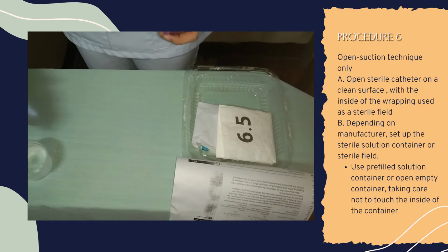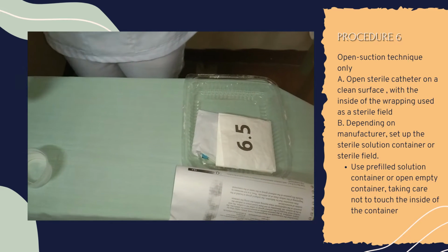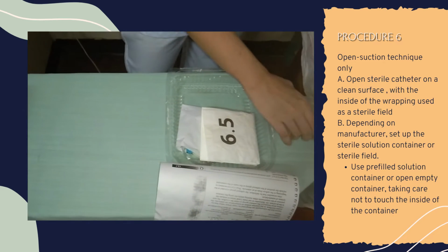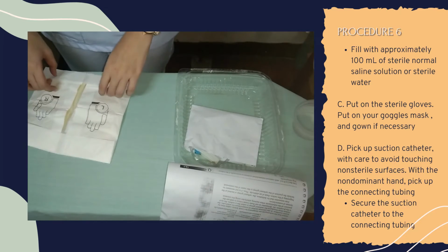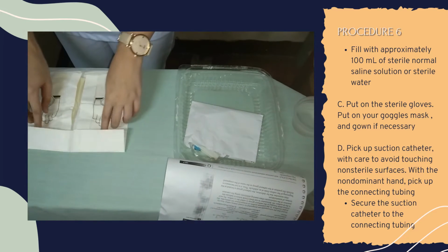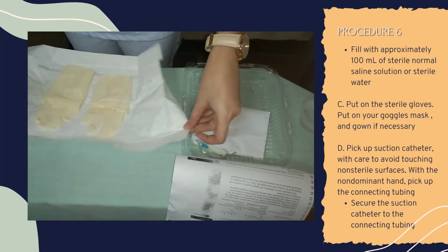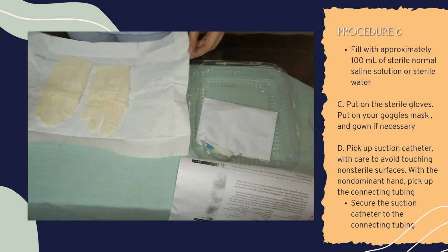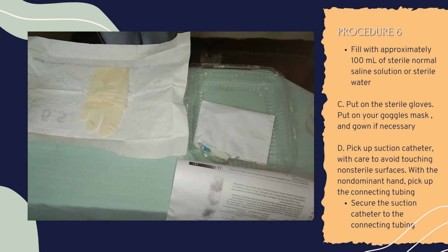Depending on manufacturer, set up the sterile solution container or sterile field. Use prefilled solution container or open empty container, taking care not to touch the inside of the container. Fill with approximately 100 ml of sterile normal saline solution or sterile water. This prepares the catheter to flush solution. Put on sterile gloves. Put on your goggles, mask, and gown if necessary. This prevents contamination of the open sterile suction catheter.